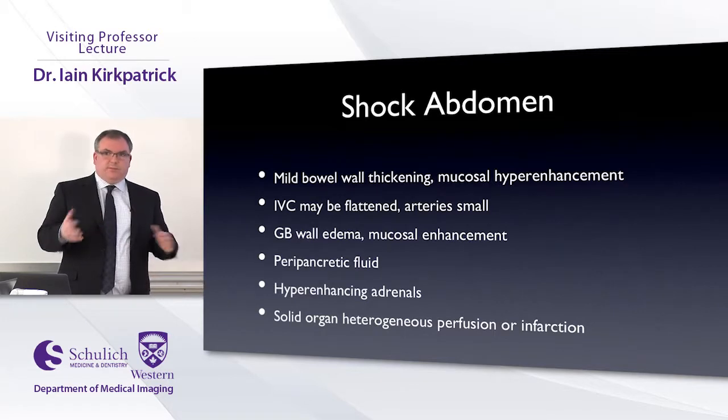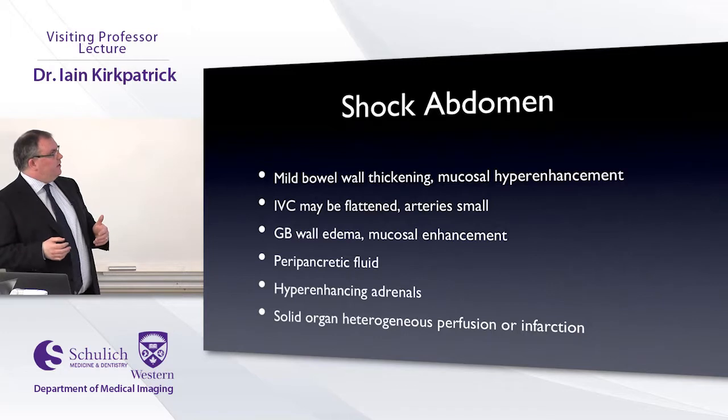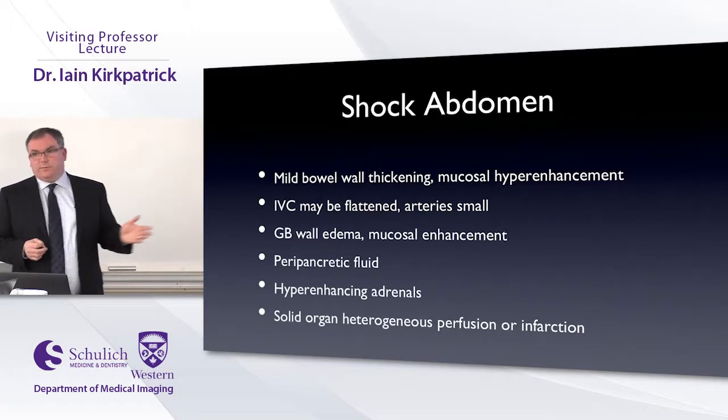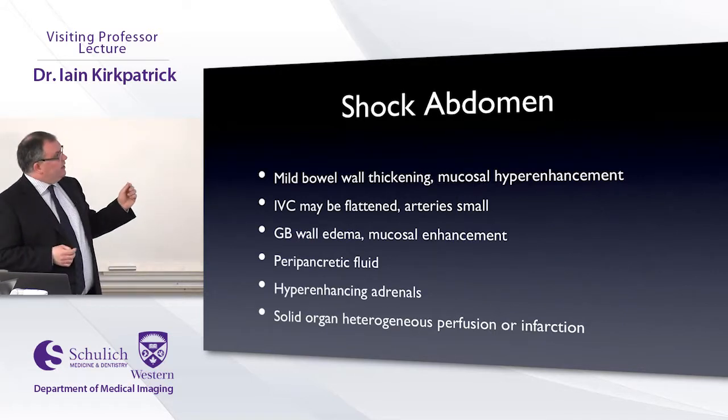They often just come to the CT scanner after they've been resuscitated. So I would not really rely on a small IVC a whole lot, but the arteries may still be small because the vasospasm can be persistent for a while. So that is a good finding, I would say.